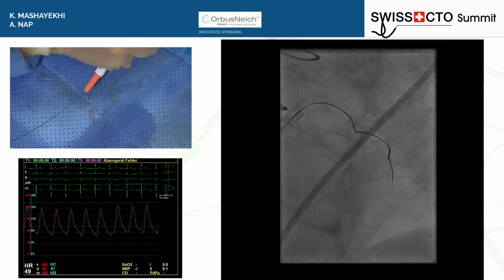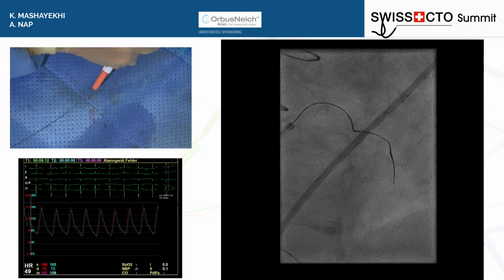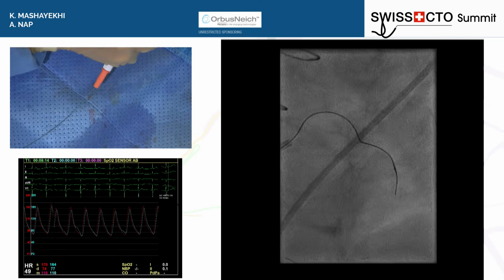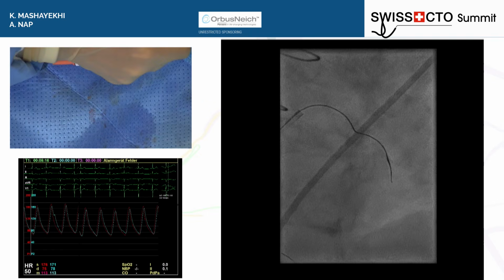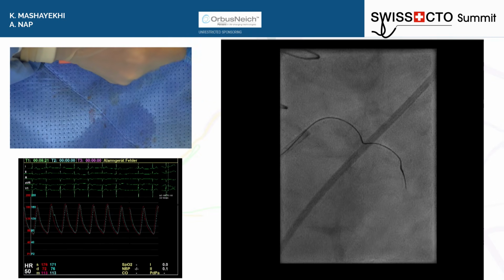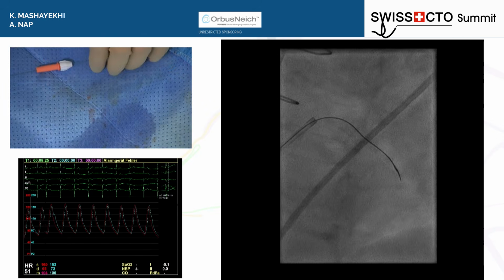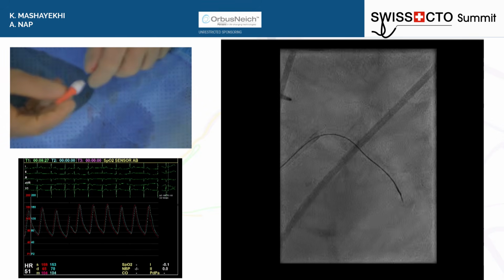But I think this may be uncrossable for the MC. For this MC, yeah. No, it works. You can see the torque okay on the MC. Can we see his hands, please, with the camera? The wire is backing out, so we have to take control of that. Wire is coming back again. Wire is coming back, yes.